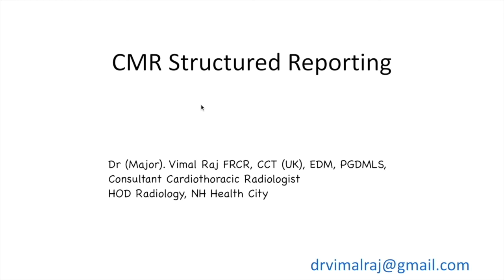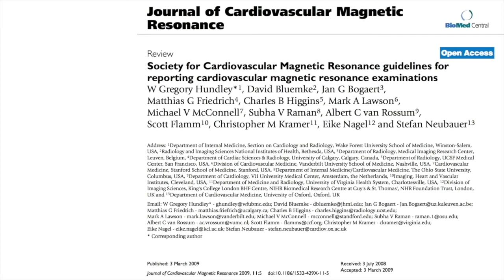Welcome to this session on cardiac MR structured reporting. One of the best references to look for structured report formalization is this guideline paper which came out of the Society of Cardiac MR, the SCMR, in their journal in year 2009, which gives you a very detailed look at how one should be reporting cardiac MR examinations.